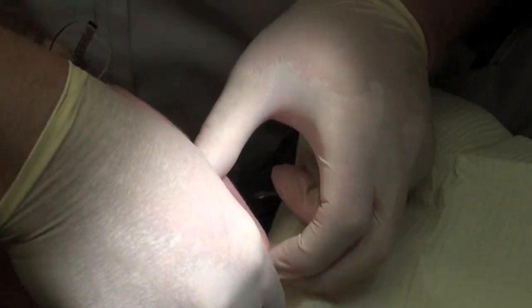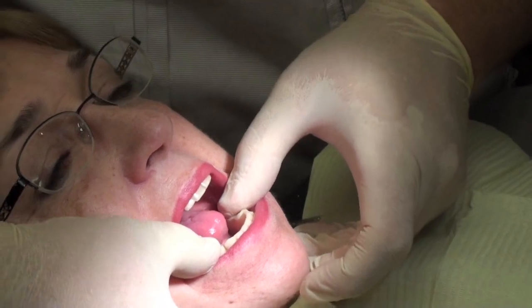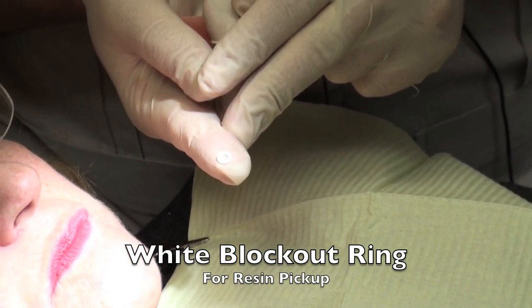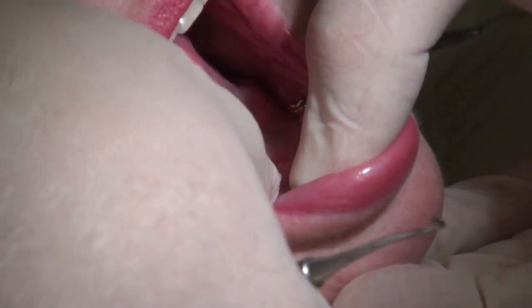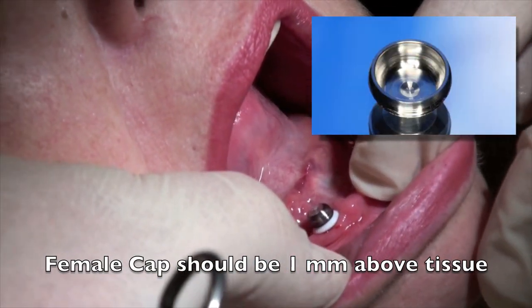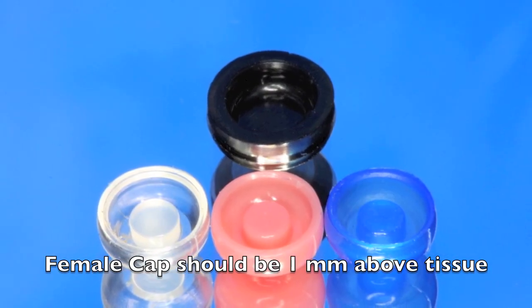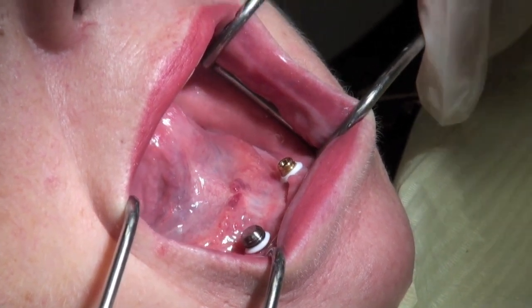Now the first thing we want to do is try the denture and make sure it fits over these locators, because we want to have enough space to pick up the housings and studs. We use a little white block-out ring to prevent the resin from sliding down the side of the implant. This is placed on, and then the cap is placed using the black standard type impression cap inside of the metal housing, as you can see here in the corner.